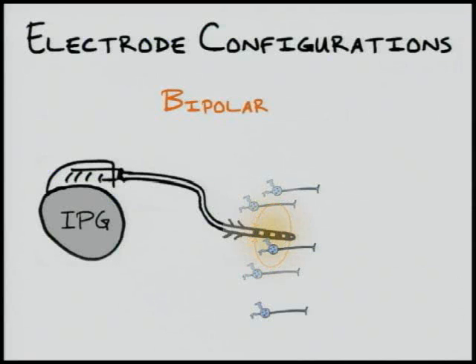The yellow shading indicates the area of stimulation when using a bipolar device configuration. The darkest coloration directly around the electrodes illustrates how only the neurons closest to the lead will be stimulated. This selective stimulation is a benefit of bipolar configuration, allowing relatively precise stimulation of targeted nerves and minimal excitation of other nearby neurons.